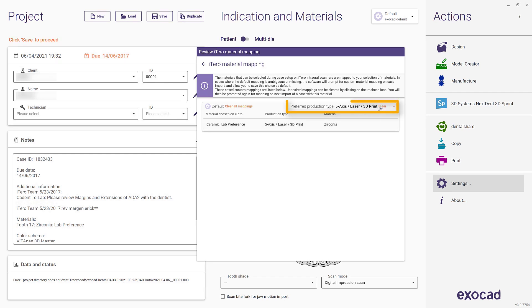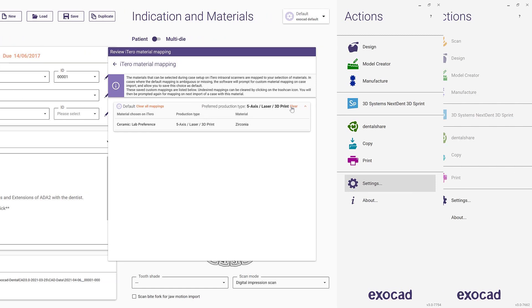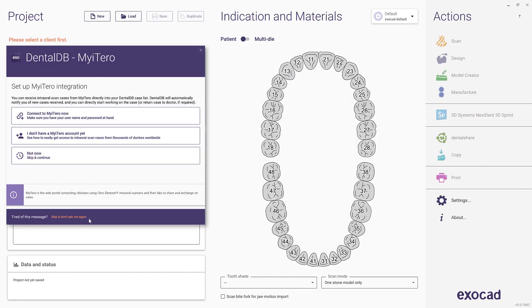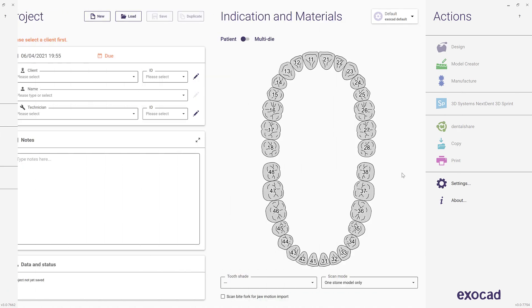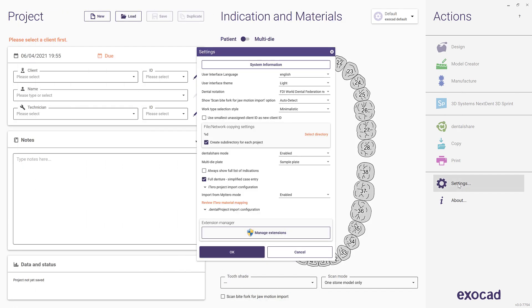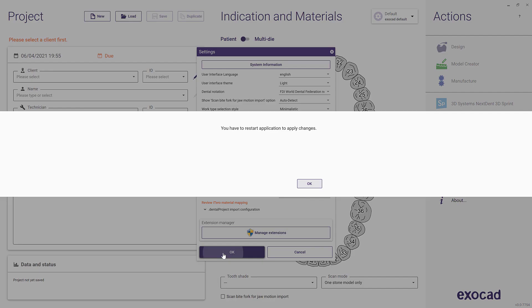Additionally, you have the option to clear the mapping for your preferred production type. If you do not wish to connect your ExoCAD installation to My iTero, please select Skip and Don't Ask Me Again in the dialog box. If you have already enabled My iTero integration and wish to disable it, open the Settings window and set My iTero integration to Disabled.